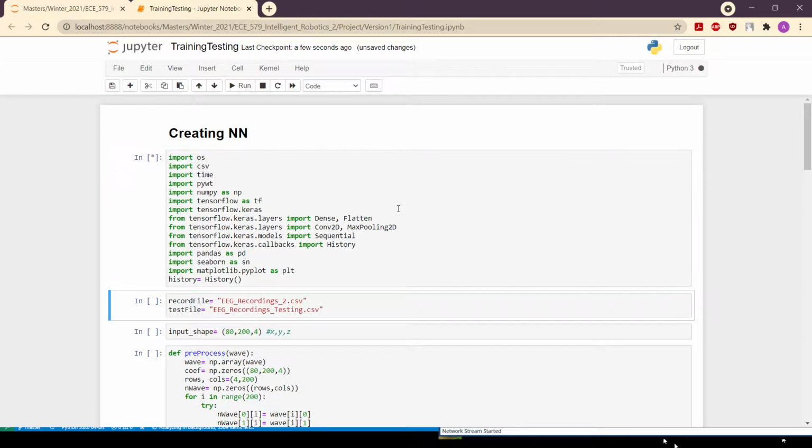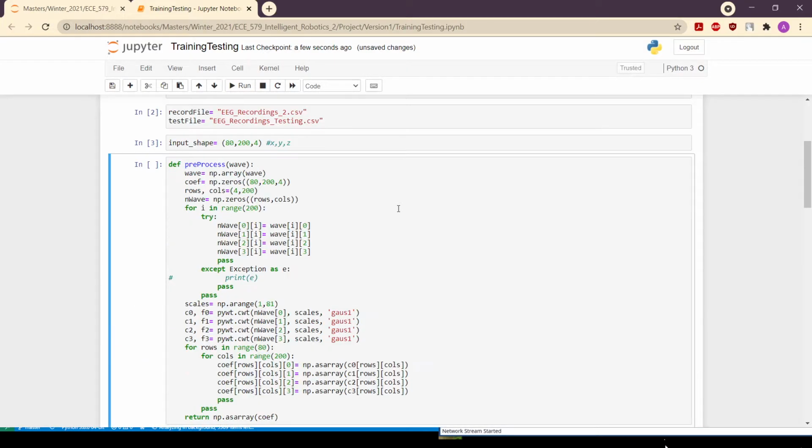Initially we import all the required libraries, and give the training set and testing set. The recorded file is the training set and the other file is the testing set, and then we give the input shape for the neural network.